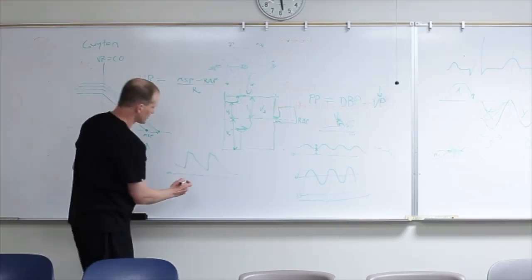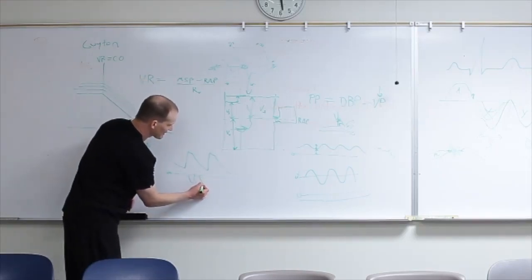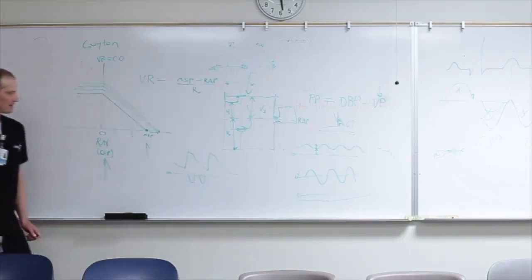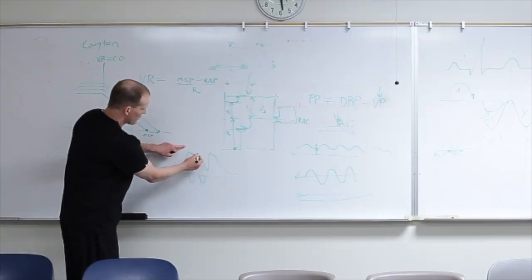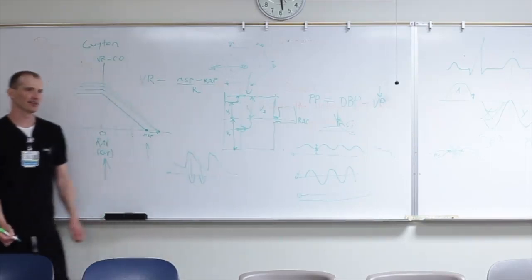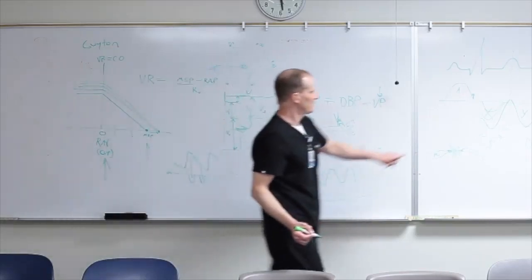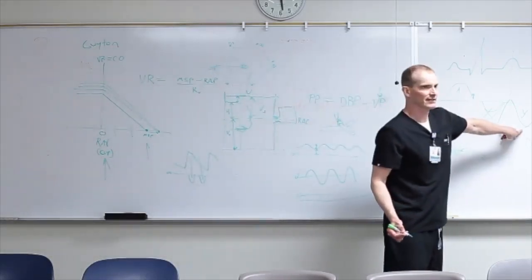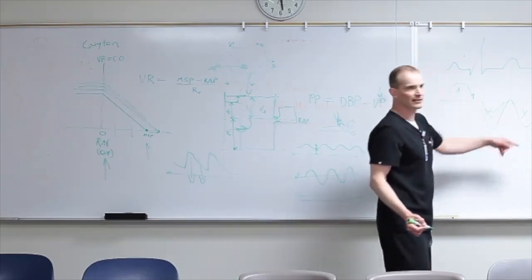And then as the pressures get higher, we see something really interesting happening. We see a biphasic pattern. One corresponds to systole and one corresponds to diastole. This is the systolic one, that's the diastolic one. We don't see the A waves on it.